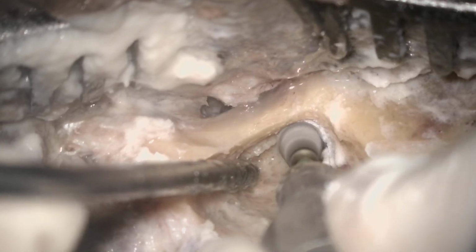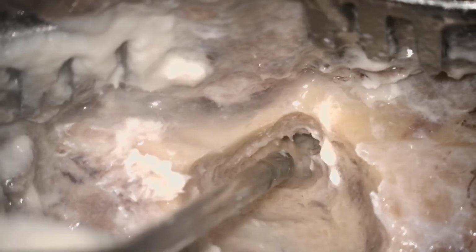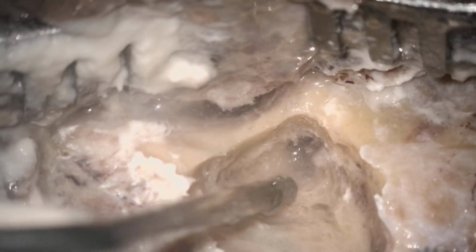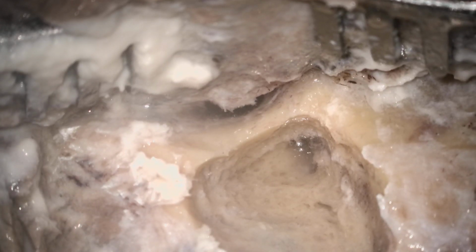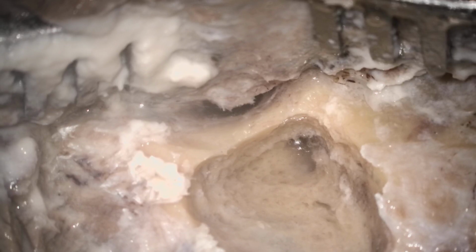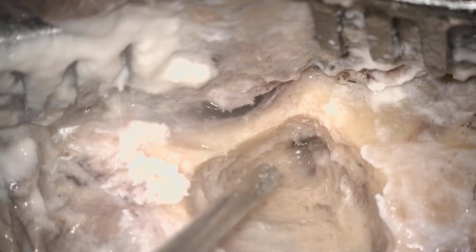Now we are going towards... At this point, can you say something about the Korner's septum? Yes, in that patient the Korner's septum was not present, but sometimes this is an anatomical or embryological remnant, where between the lateral and the medial cells there will be a septum-like structure, and that obscures the view of the mastoid antrum. In those cases we usually think that we have reached the mastoid antrum, but actually the mastoid antrum is medial to the Korner's septum.